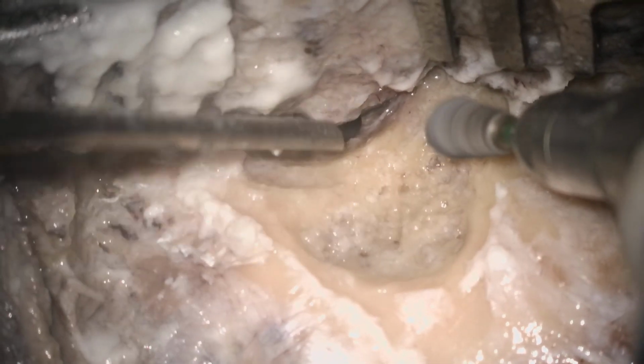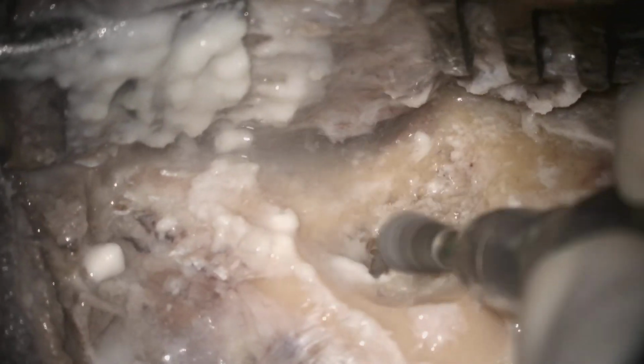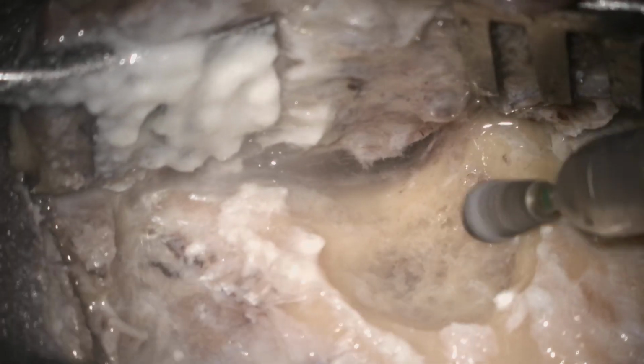So in every case you have to delineate the important landmarks, and when we go step by step dissecting all the bony architecture to identify the landmarks, look at the direction of the drilling. In the superior part, you will drill along the tegmen plate like that.